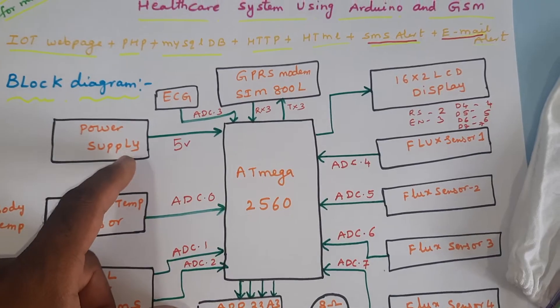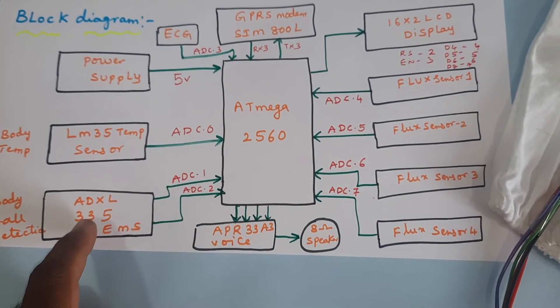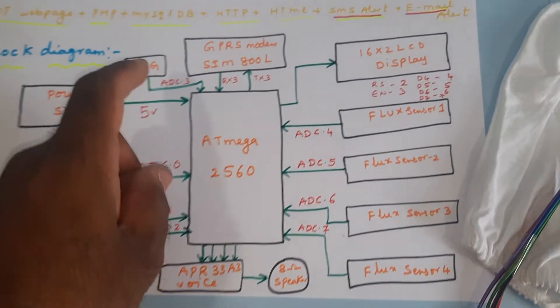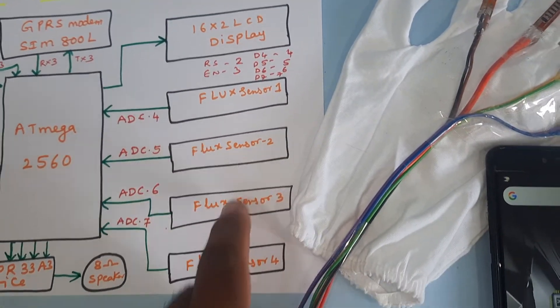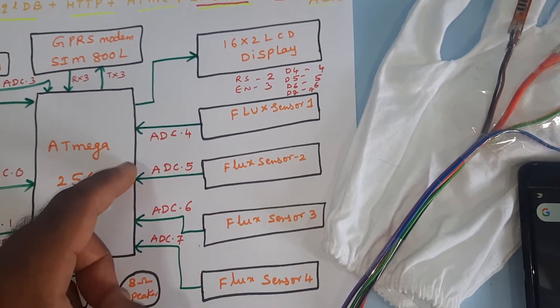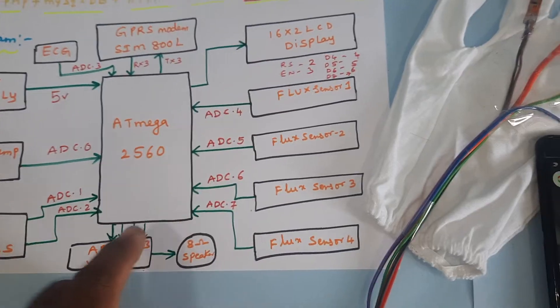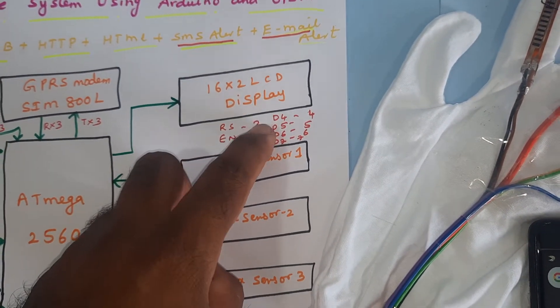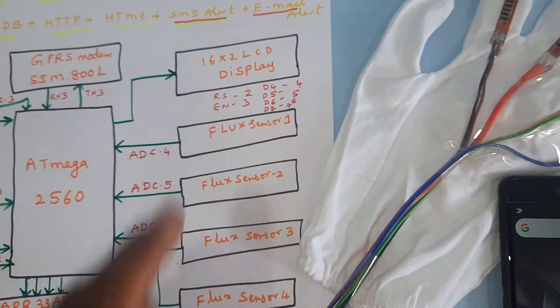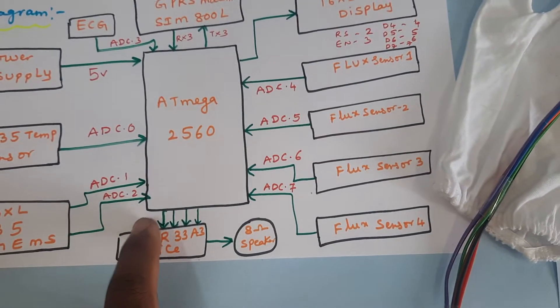The 5V power supply, LM35 temperature sensor on ADC0, ADXL335 on ADC1 and ADC2, ECG sensor on ADC3, and flex sensors one through four on ADC4 through ADC7 handle analog-to-digital conversions. The 16x2 LCD display uses pins RS, Enable, D4, D5, D6, D7 mapped to pins 2 through 7.